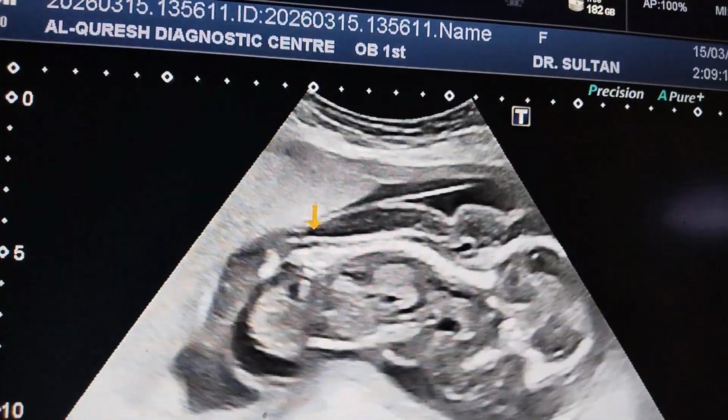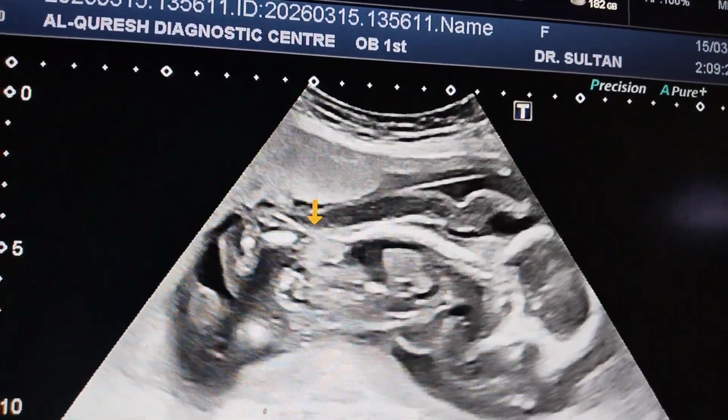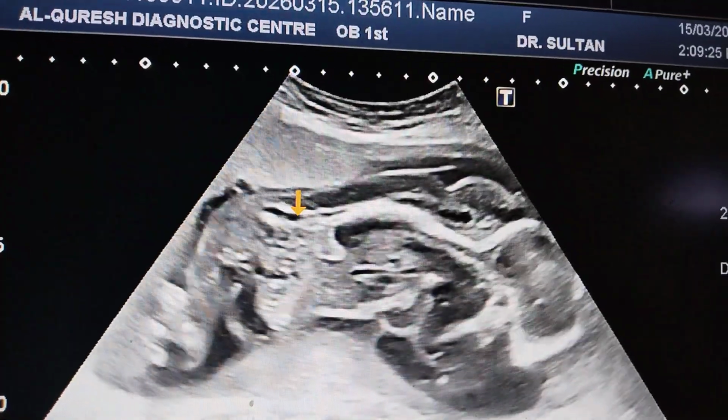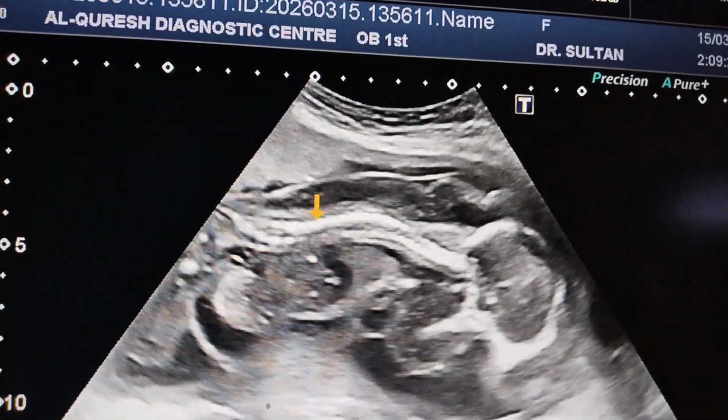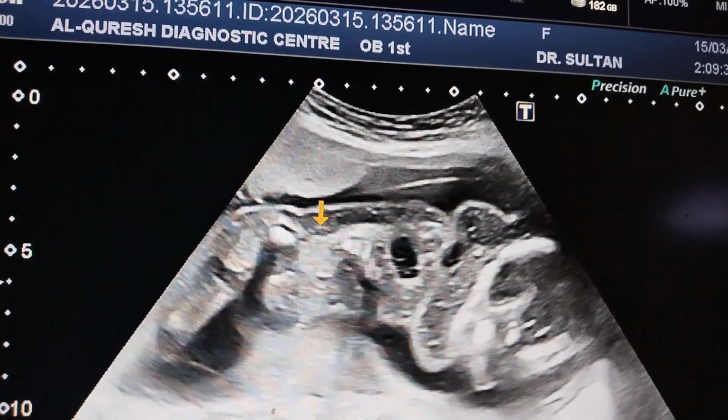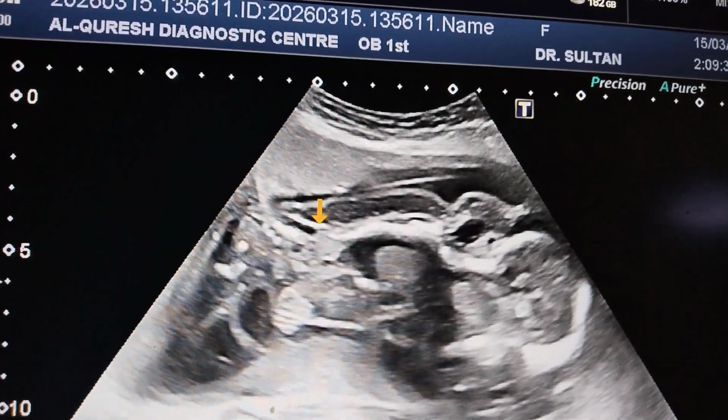And when there is immune hydrops fetalis, there would be severe anemia. In non-immune, the anemia is less common as compared to the immune hydrops fetalis.